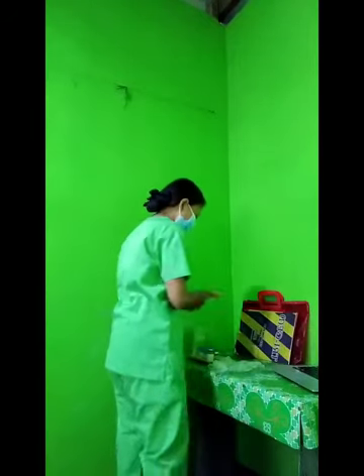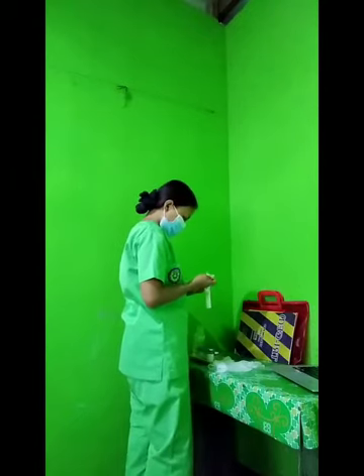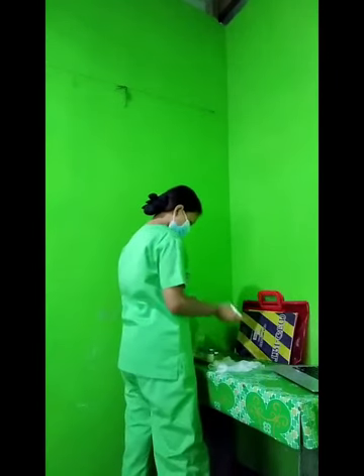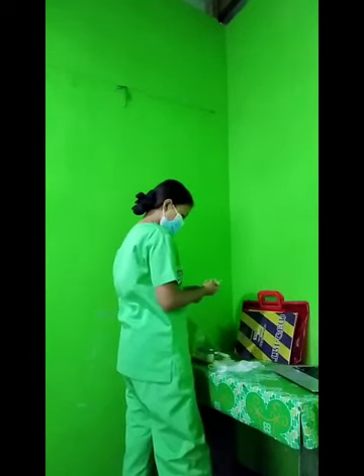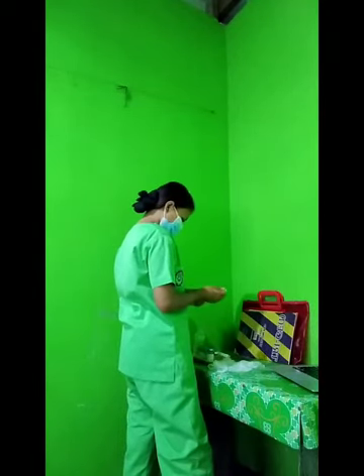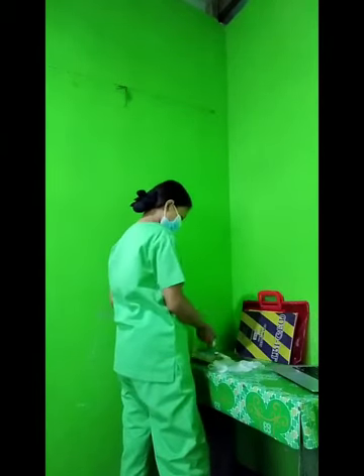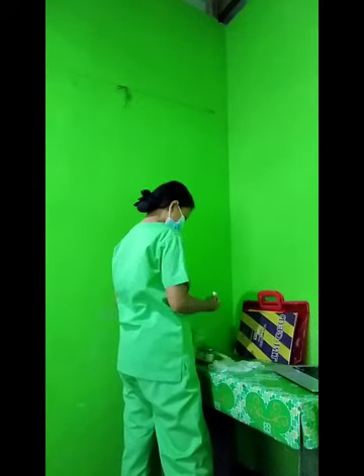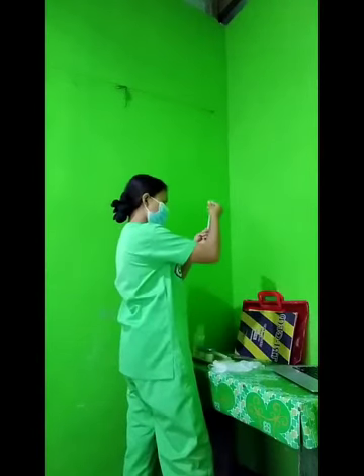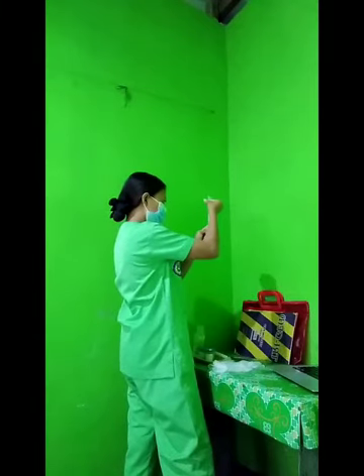Then, withdraw the medication from the ampule. And check for the level.